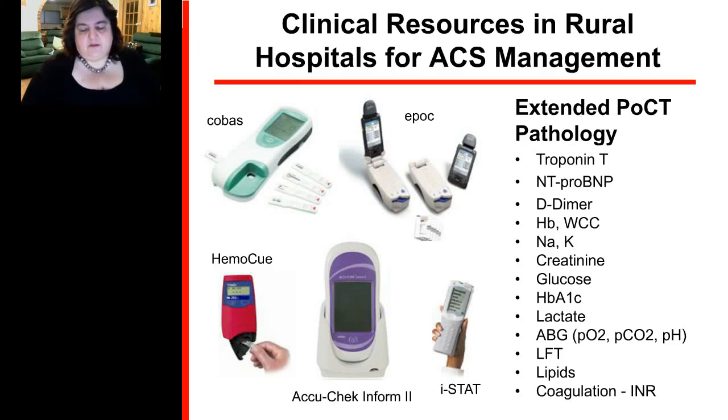That was a fantastic achievement, really, to know that a basic electrolyte and blood gas could be done in all of our hospitals, when previously, if they needed monitoring of their electrolytes, they would have to be transferred to Adelaide to get that done.